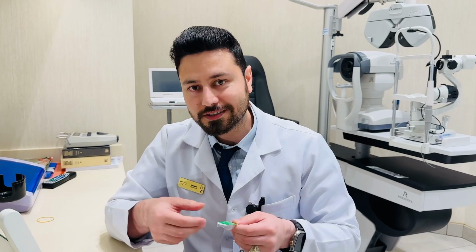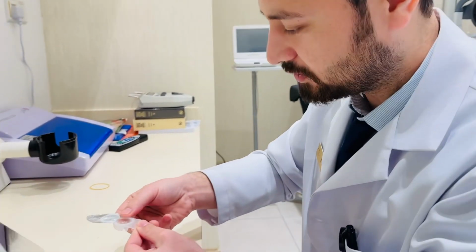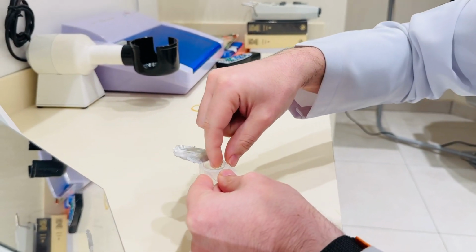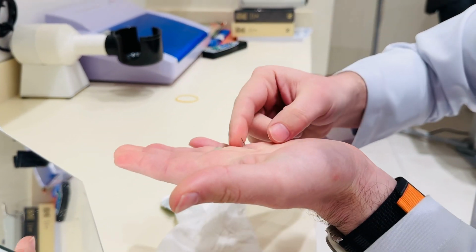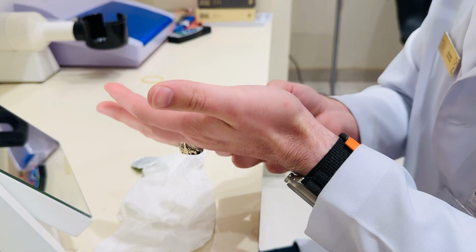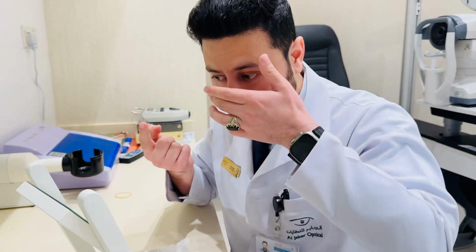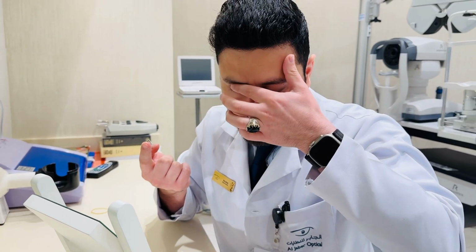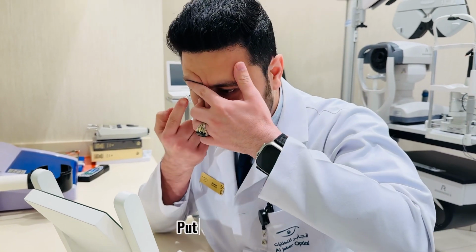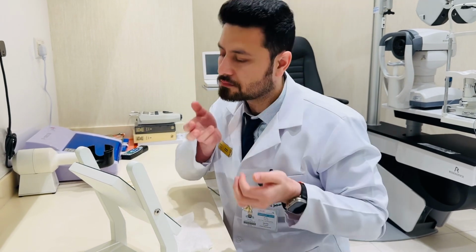So how to insert the contact lens? First, when you open the contact lens, you will take it in the palm. After washing the hands and everything clean, then you will take it with the index finger. So this is how we insert the contact lens.